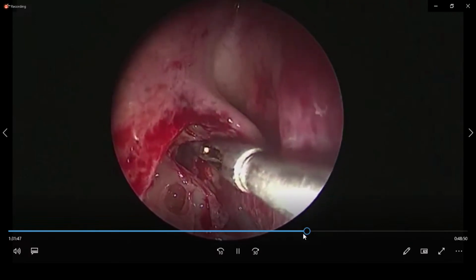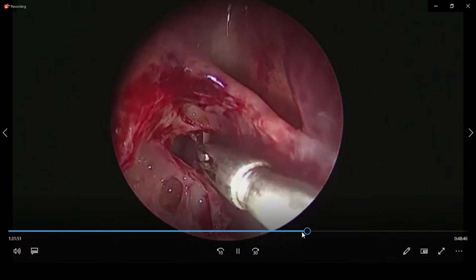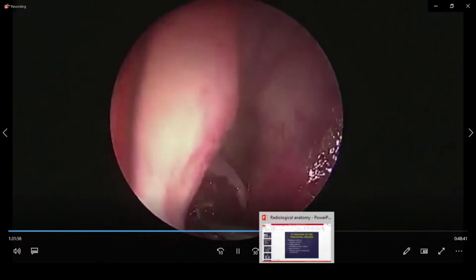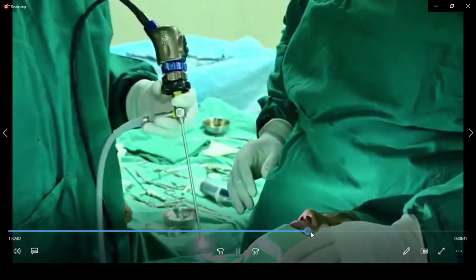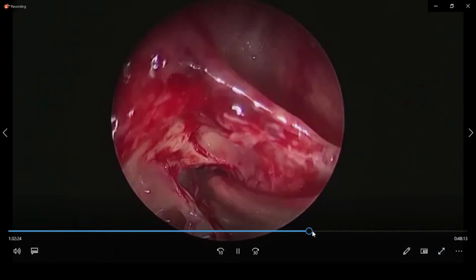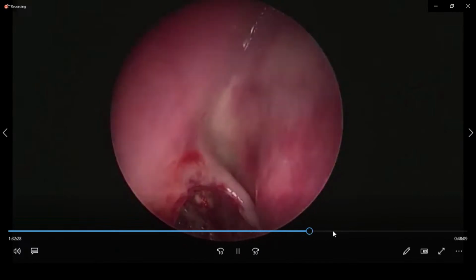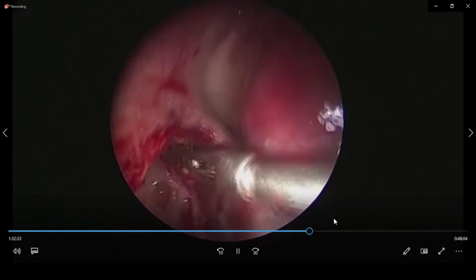See this septation can be removed by means of a giraffe forceps, horizontally opening giraffe forceps. That's the cell. Rest can be debrided and this area can be widened. See this? It can be widened. See more cell wall coming. You can remove it again and widen it. See this, more cell wall coming.